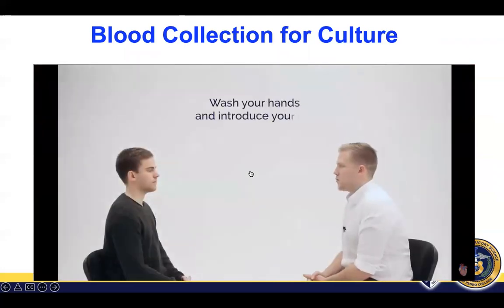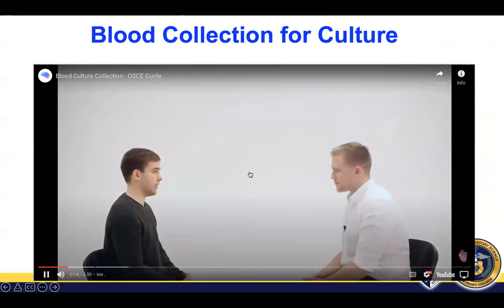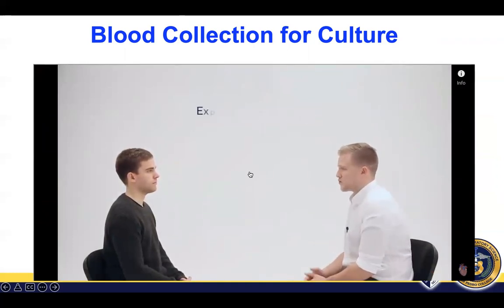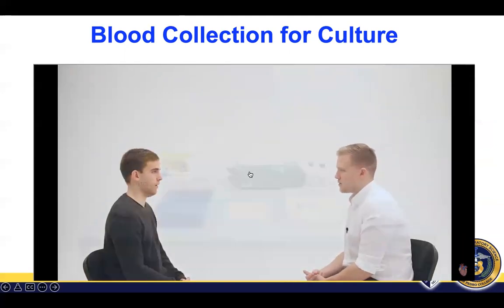Hi there, my name's Andrew. I'm one of the final year medical students. Could I just confirm your name and date of birth, please? Sure, it's James, 13th of December, 1989. Nice to meet you, James. James, today I've been asked to take a blood test from you. This will just involve inserting a small needle into one of your veins and taking a sample, and that'll be sent to test for any infection within the blood. Would that be okay? Yeah, that's fine.